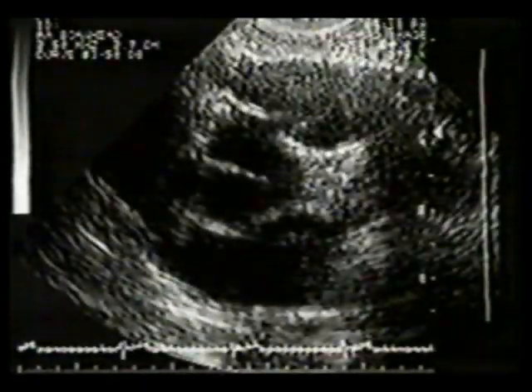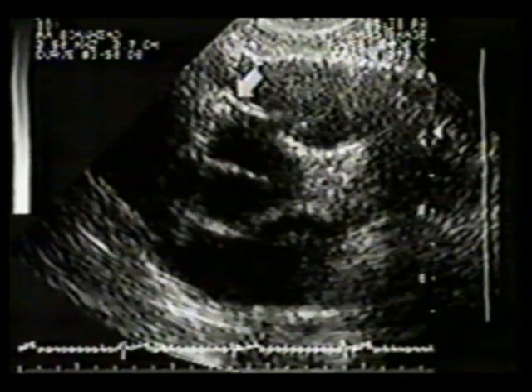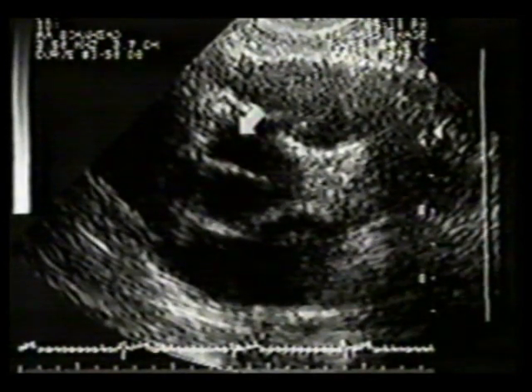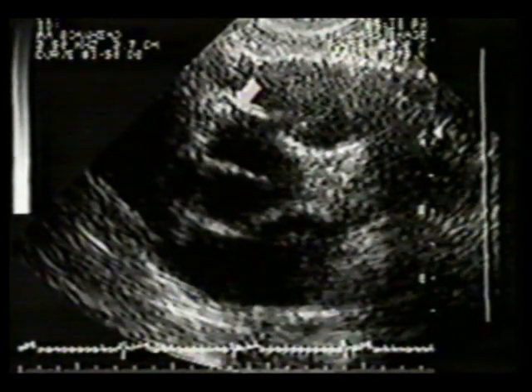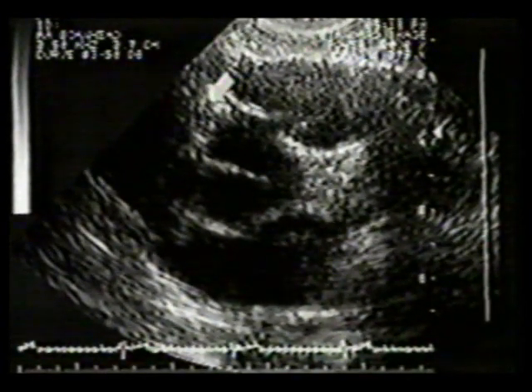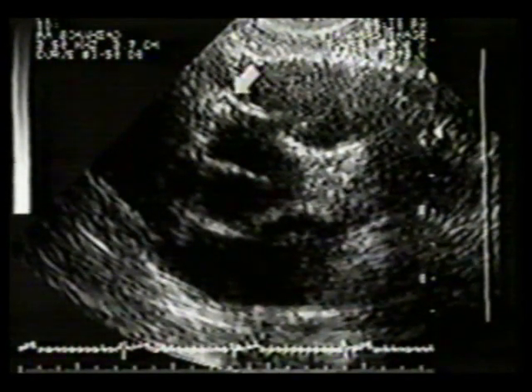The right coronary artery can also be identified echocardiographically, originating from the right coronary sinus of Valsalva. Here is the ostium of the right coronary artery and a short segment of the proximal right coronary artery, which is a small vessel in this particular subject.